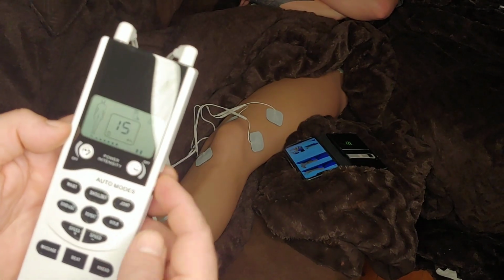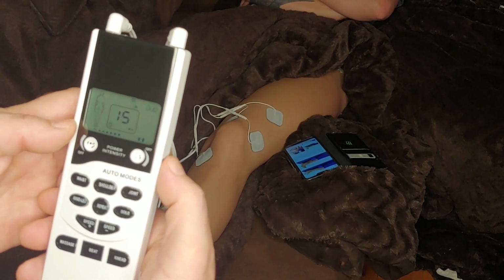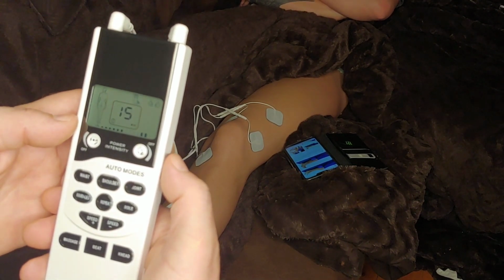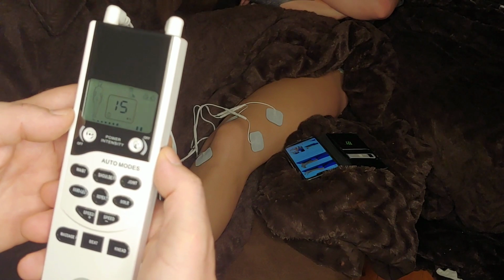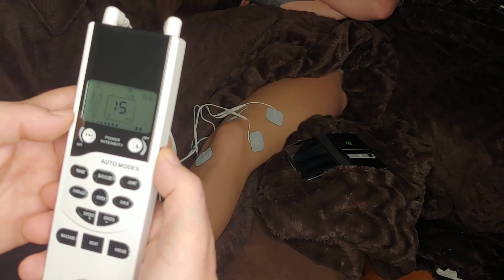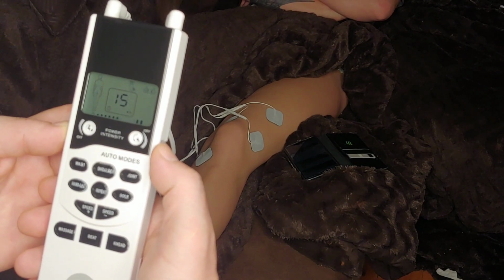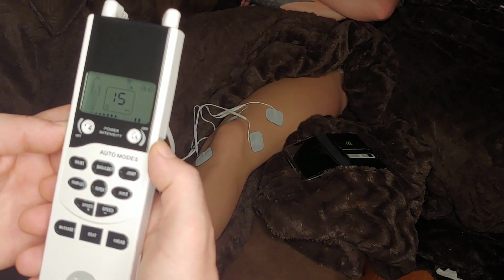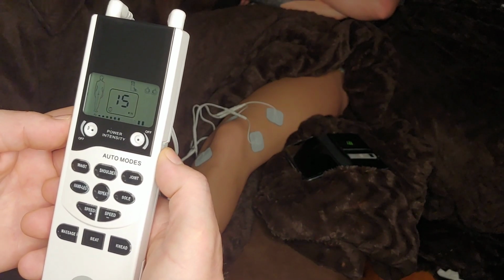There's 2. Okay, I want to start the other side now too, because I've realized we have both sets on. So there comes the other side. That's 1. There's 2. Do you want more? Okay, I'm taking the new set up more. We're at 2.5. Well, no, we're at 3. Do you feel it? If she feels it, it's 4. So I'm going to take up the first set. There's 3. There's 4. More. There's 5. Now we're at 5 on both sets.